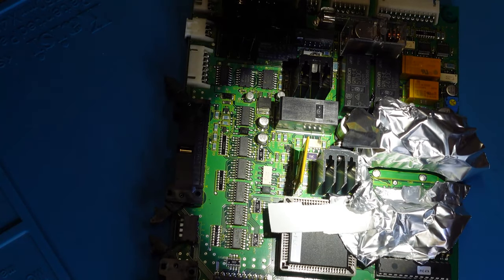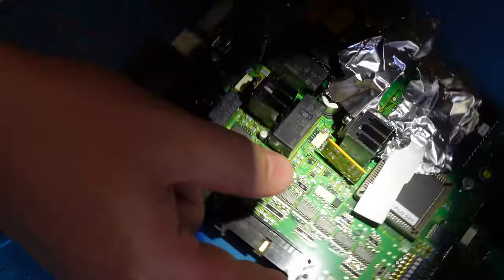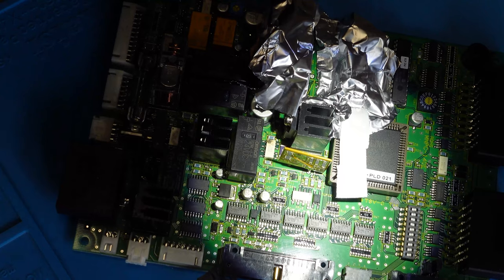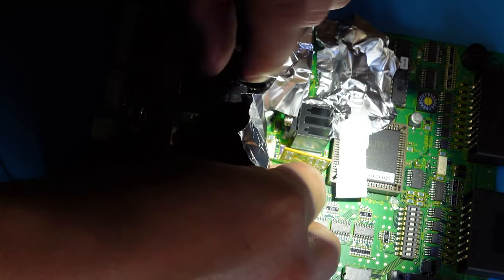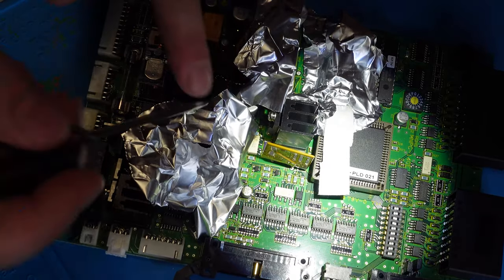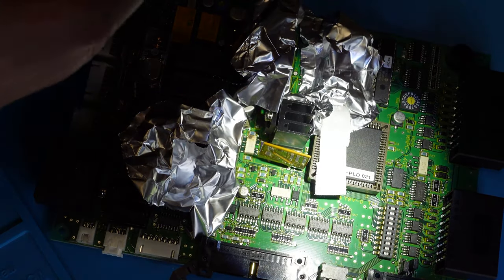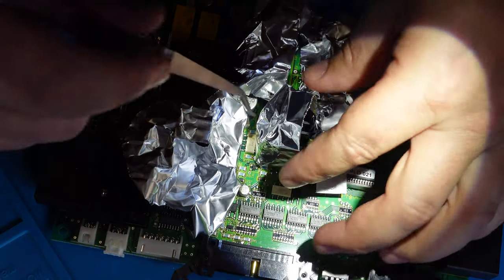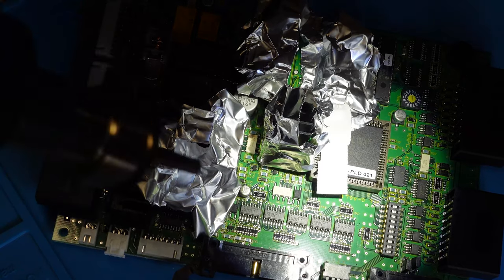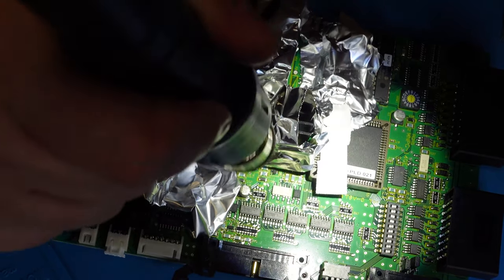The next component that I'm going to get is that photo solid state relay right there. Let's see if I can get it at this angle so that the camera can see it. Okay, let's do it. Actually, let's mask off some areas first. That board is hot. You know it. Definitely warm. Okay, let's do it. 400 degrees. I've got to heat up the board a little bit on this side.